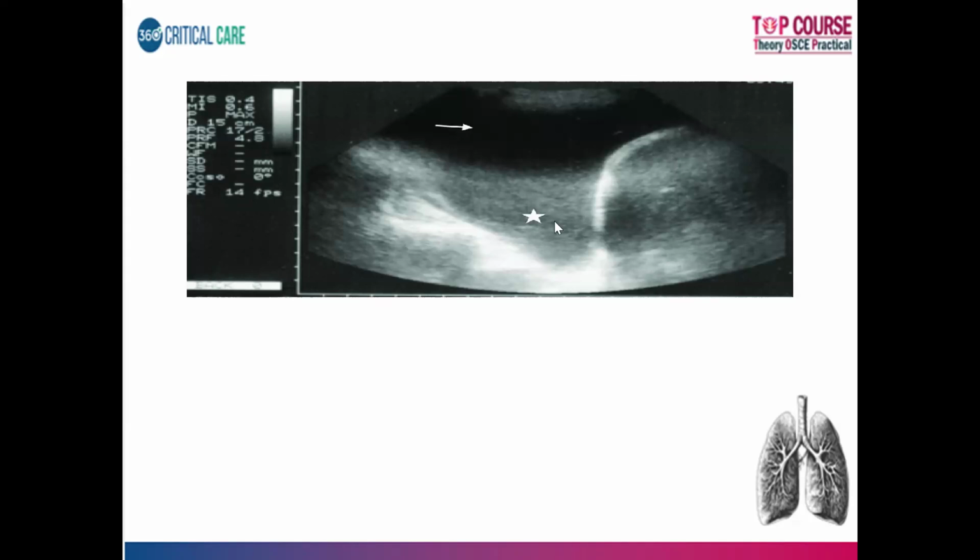Okay. So it's called a hematocrit sign. You see there is some amount of debris collecting in the dependent part of the lung ultrasound. Whenever you have debris and the above part is anechoic, usually referring to effusion, we should think about the presence of blood. It can be an exudate as well, but this sign particularly is called the hematocrit sign.